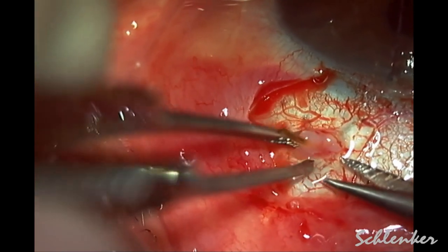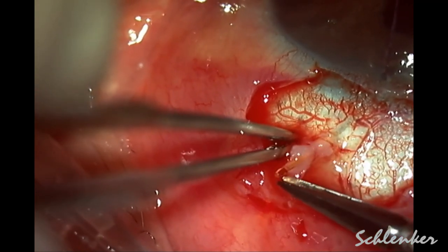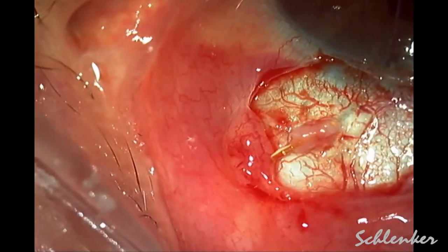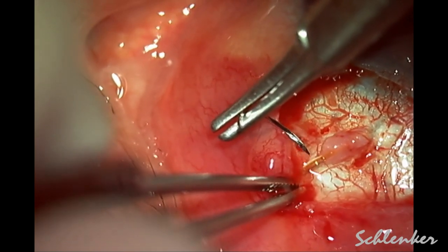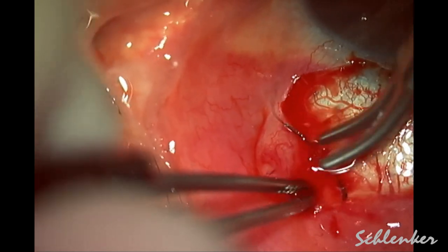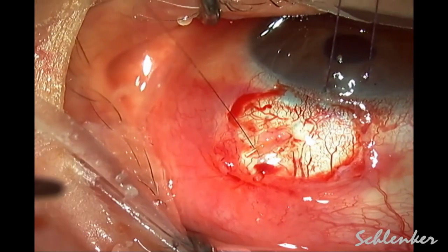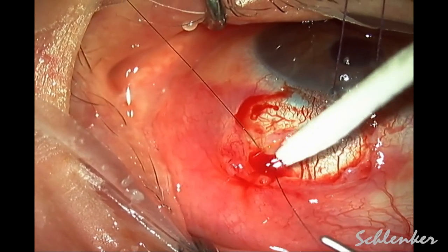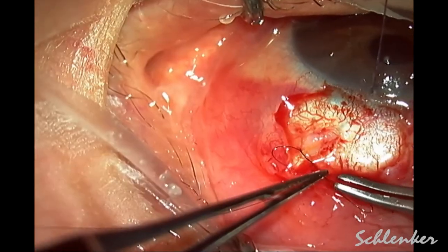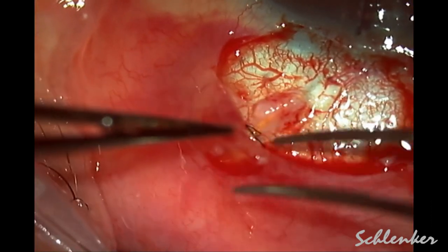Now we are double-checking the flow and doing a little more cleanup around the micro stent. Our concern at this point was that the micro stent was sticking up slightly and could be occluded by the conjunctival tissue. So we made the decision to use a 10-0 nylon cross stitch to redirect the Xen gently so that the flow was more parallel to the closure and more posterior. You want to be careful not to tighten this too much so as to potentially damage or occlude the micro stent — we did a 3-1-1 tie, paying careful attention not to over-tighten, and then buried this area.